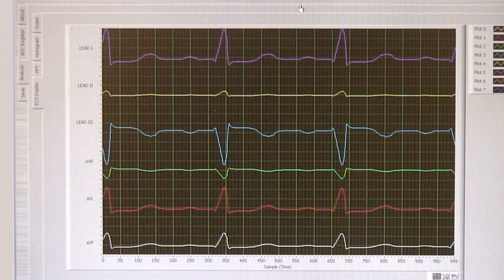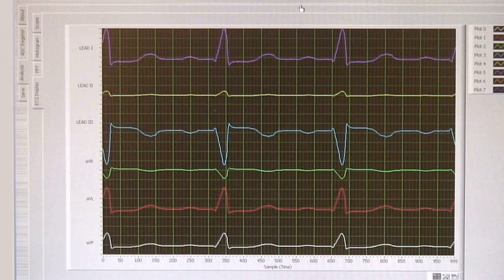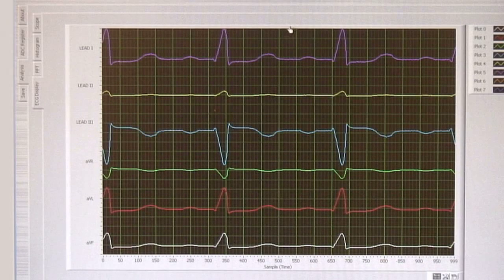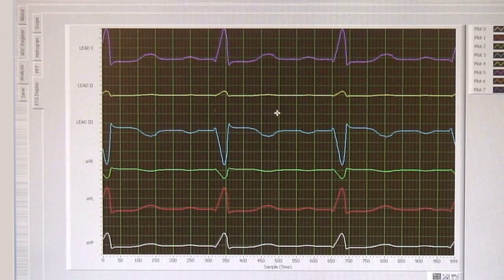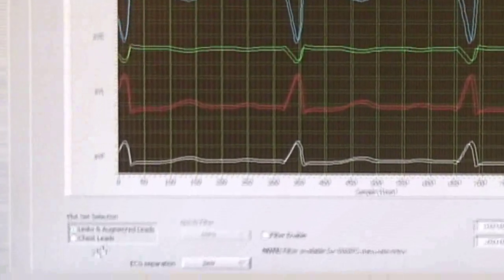And there you are. The primary and augmented leads are shown in this graph and a radio button selector at the bottom of the graph switches the display to the chest leads.